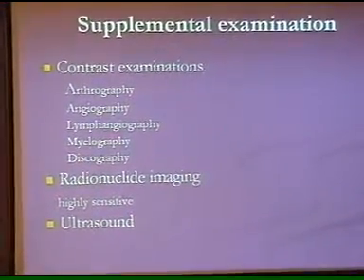It's highly sensitive, but at places you can't differentiate between primary or secondary or metastatic or inflammatory diseases. But the history of the patient, the age of the patient, and then the findings can help you reach a quick diagnosis for multiple areas involved in that case.